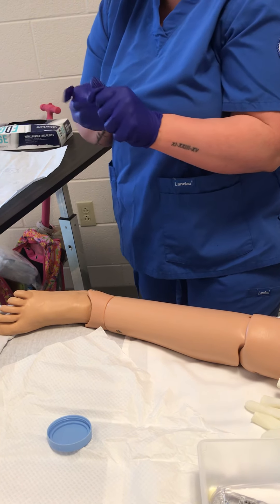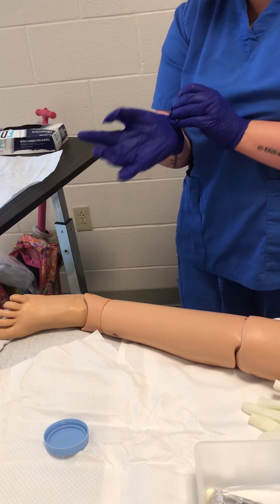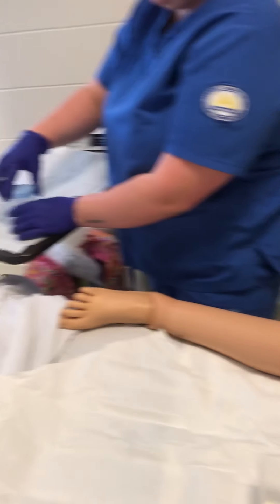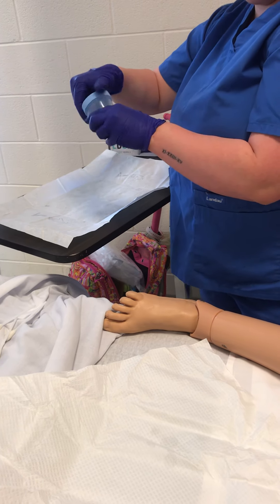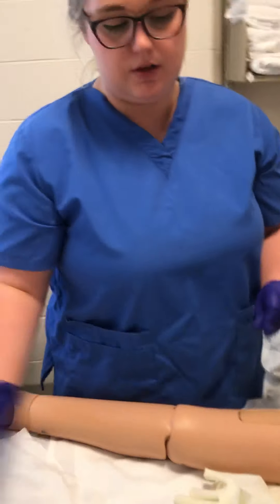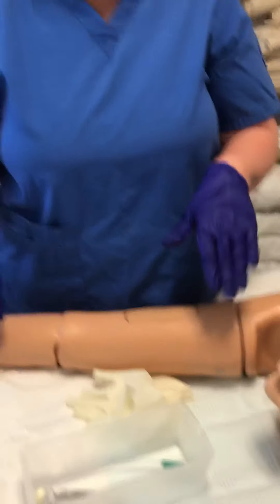I'm going to put my gloves back on, put the lid on the urine sample, and check and verify the name and birth date one more time. Then throw all this stuff away and do peri care one more time.